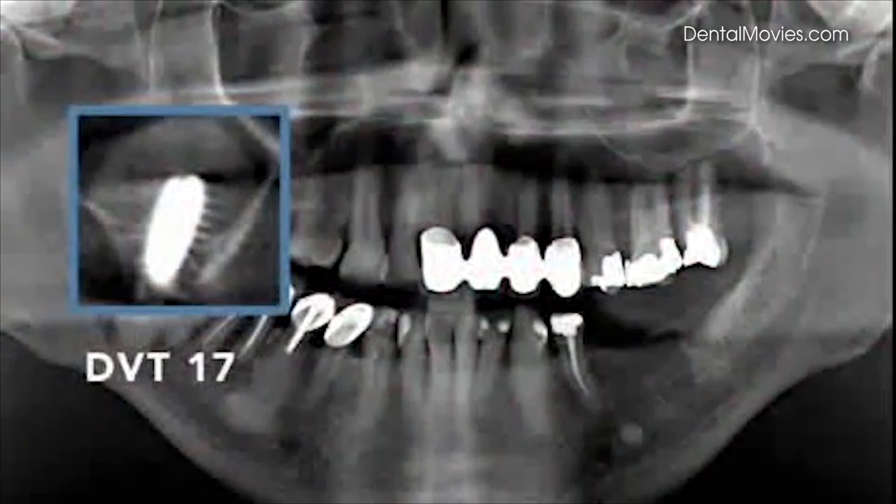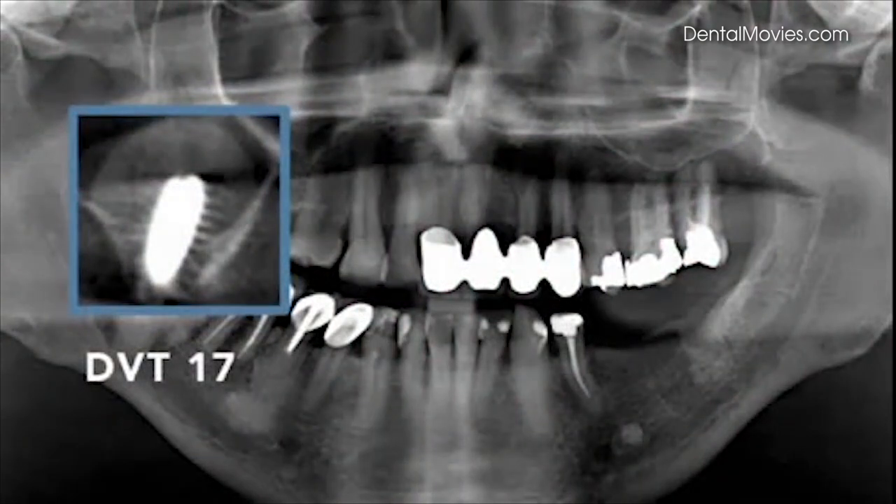The bone height could be augmented from 6 to 14 mm.